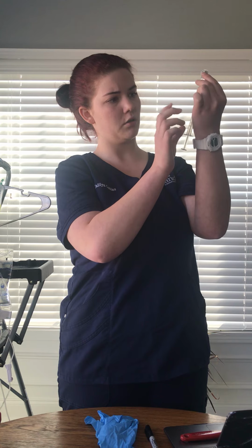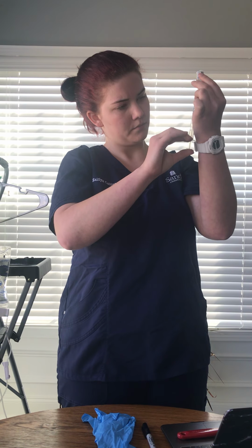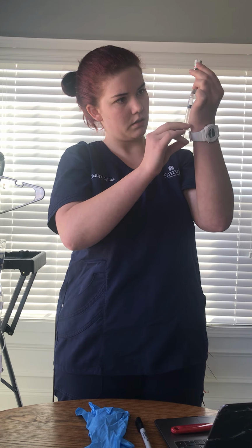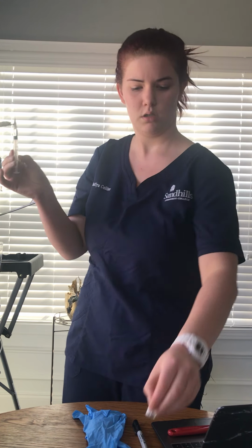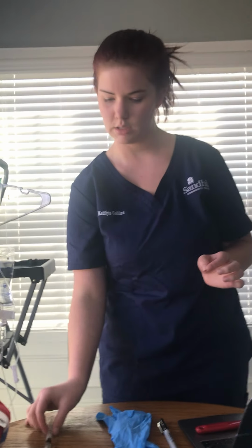I'm just drawing up a little bit more to try to get these bubbles out. All right. I've got 1 milliliter of lorazepam, and using the scoop method, I'm going to recap so that I can dilute it with the diluent.